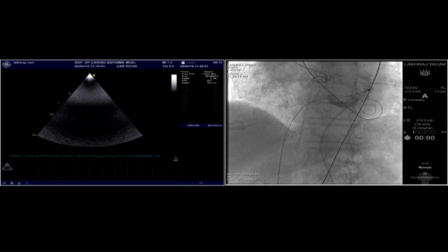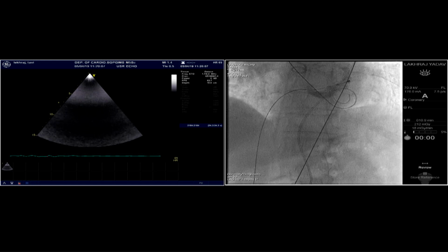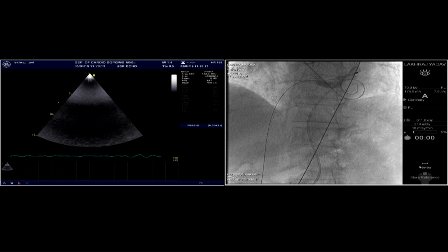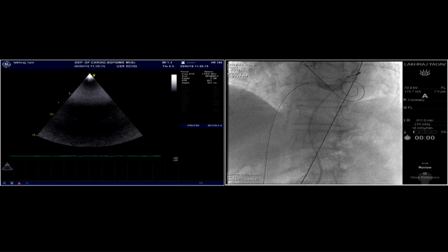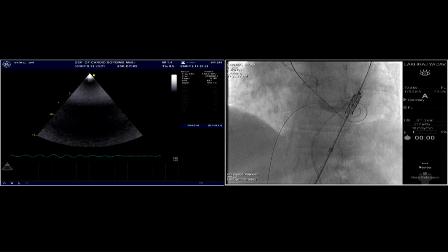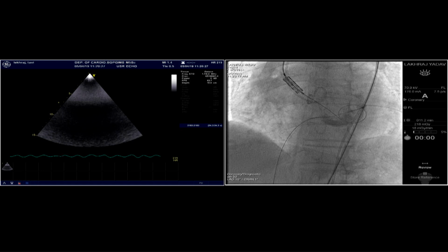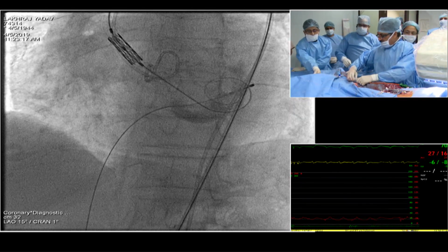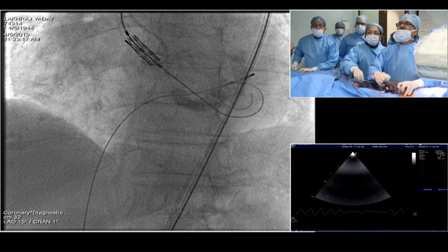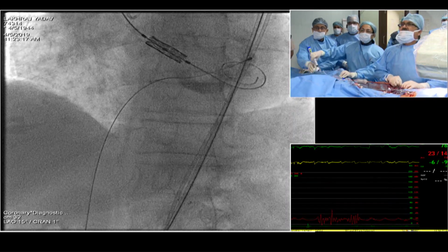Wire fixed. The second possibility is the wire is pinning open an aortic leaflet or even caught up in the mitral valve apparatus. Wire fixed. So that's going through the sheath. That's the valve going up. Push the noradrenaline, everything. Give a bolus of adrenaline. Give 1 ml. I will tell you when, hold it outside. Fix the wire. Okay, mark has crossed.